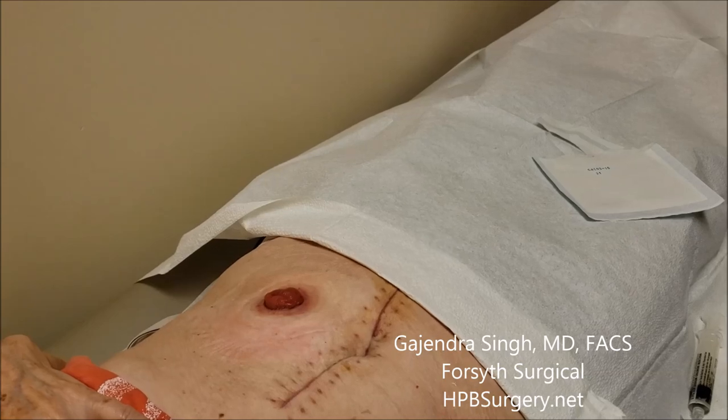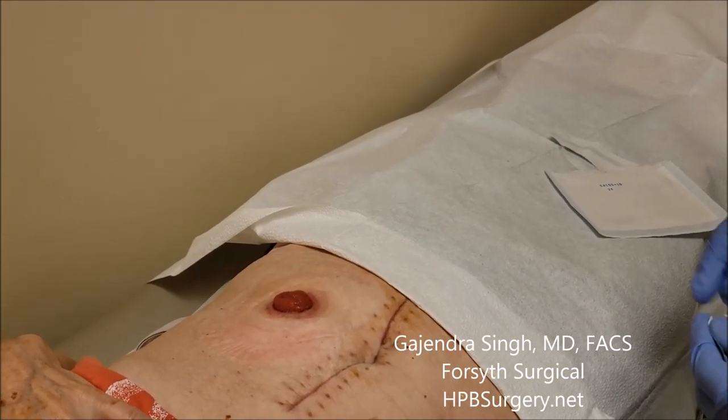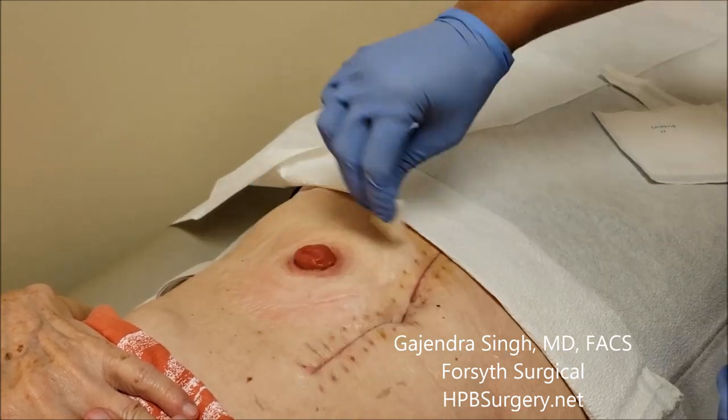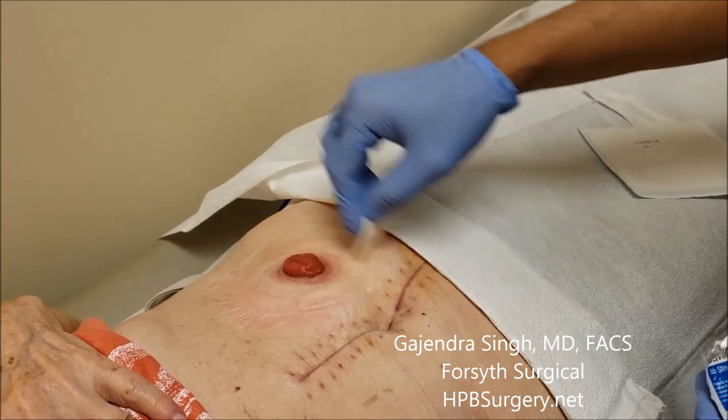We've cleaned out all the stool from around the area. We're going to take a new sponge from the pouch and clean all that out to make the skin a little sticky, then let it dry before putting the new bag on.